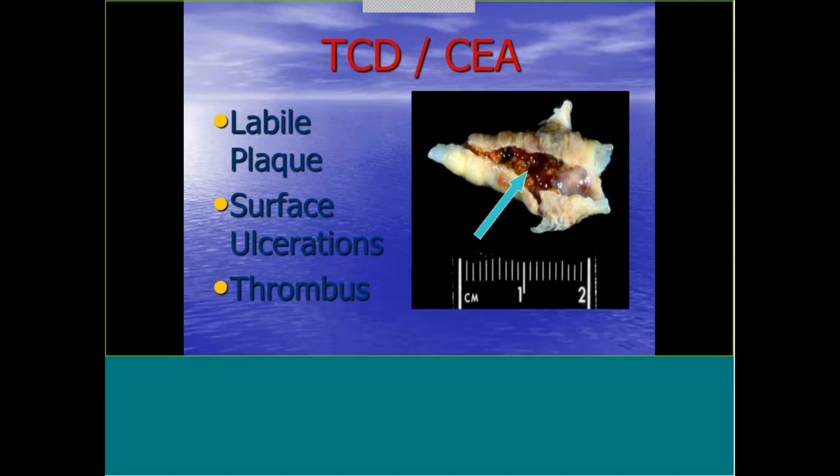I just want you to know that the plaque may be very labile. When the surgeon comes in, I say to the surgeon, I was hearing emboli, just for your information, just during skin scrub. And the surgeon is going to be very careful with dissection down into isolating these vessels.